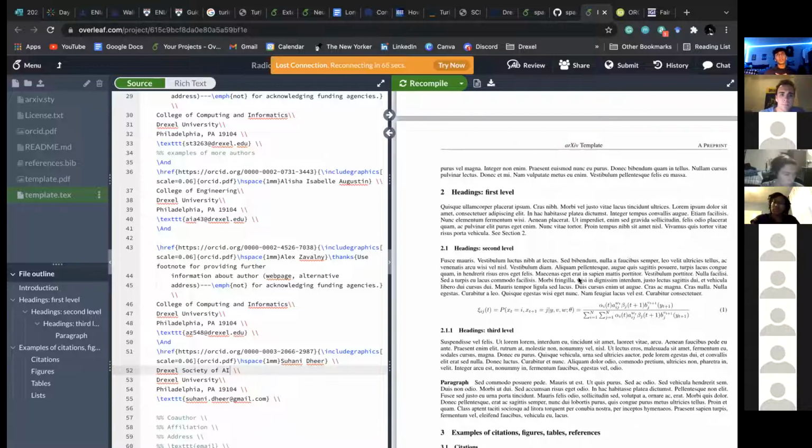Second, the pre-processing and the segmentation process. Third, the exploration part. Fourth, the application of deep learning. Then we come to results, where we present all the graphs and tables that we have generated and the actual results, how the classification came out to be.